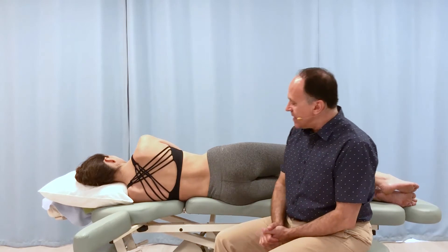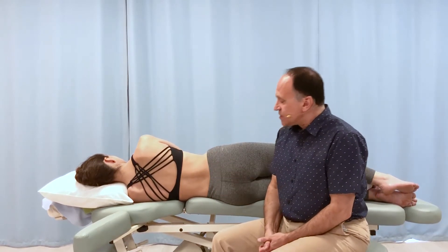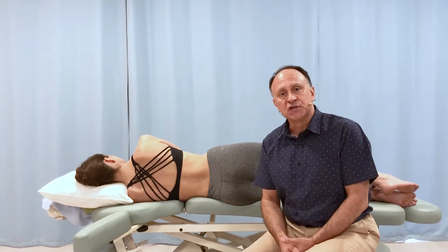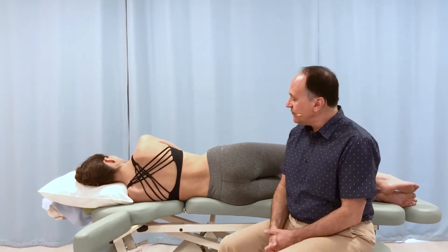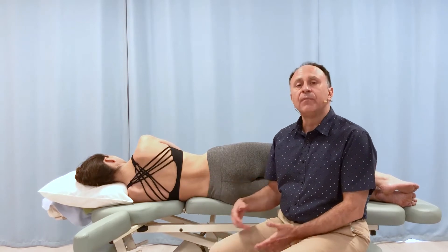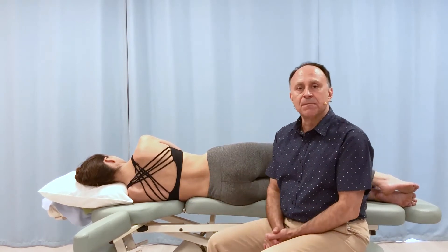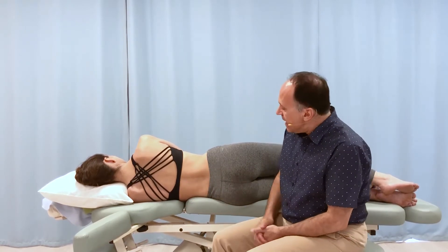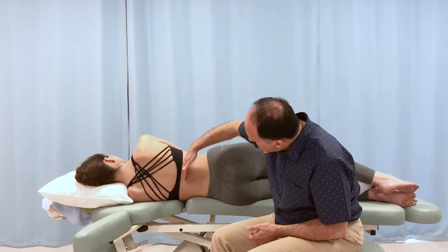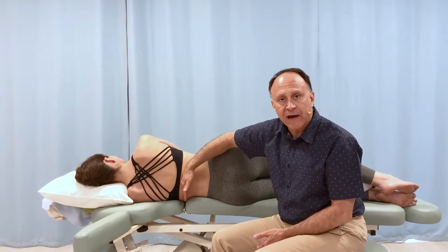But now we have Catherine, our model, lying on her left side, so in effect it's a lateral flexion break feature that we're taking advantage of. Catherine does not have a scoliotic curve, but we're using her as a model to demonstrate how this might work. If she had a scoliotic curve, right now we have the break in the table right around T12L1.